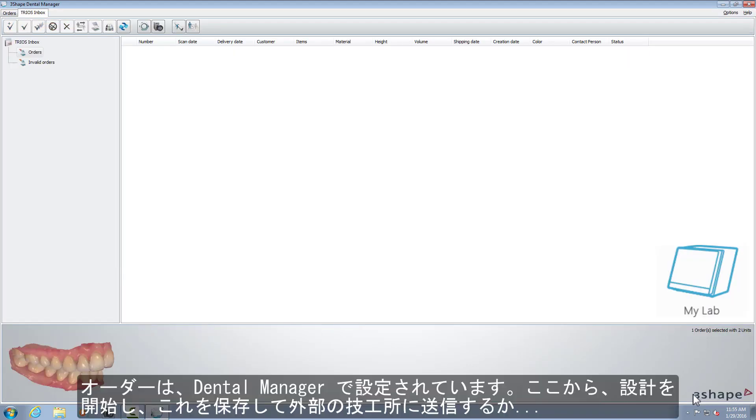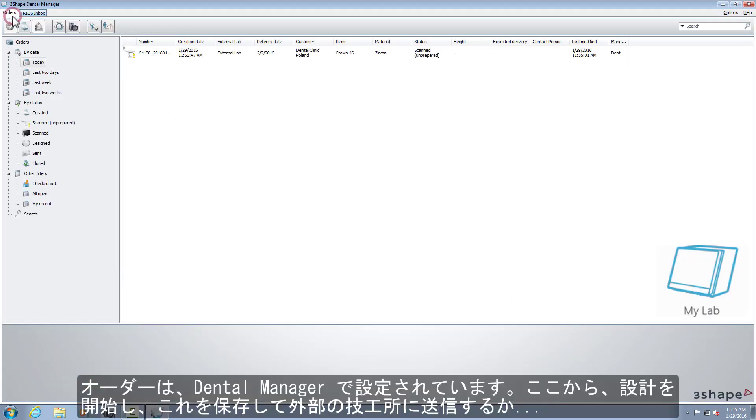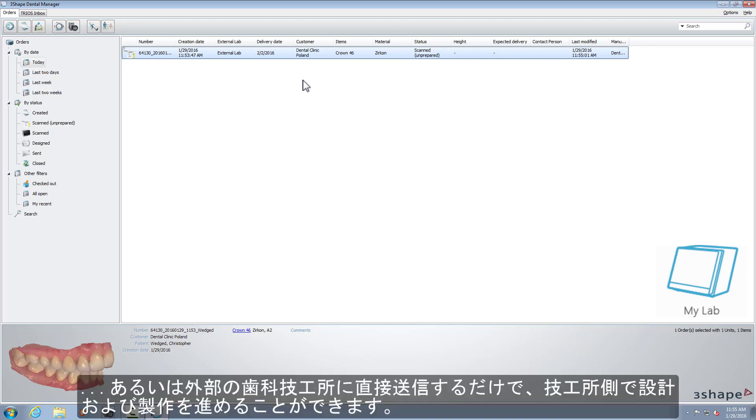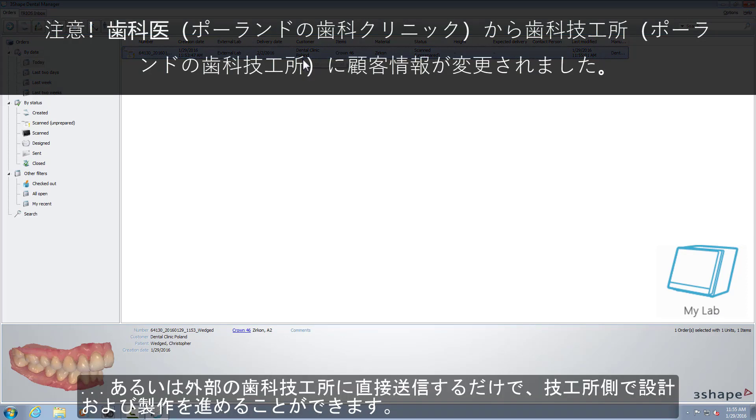The order has been set in the Dental Manager. From here, you can decide either to start designing, save it and send it to an external lab, or just send it directly to an external lab so they can proceed with the design and or production.